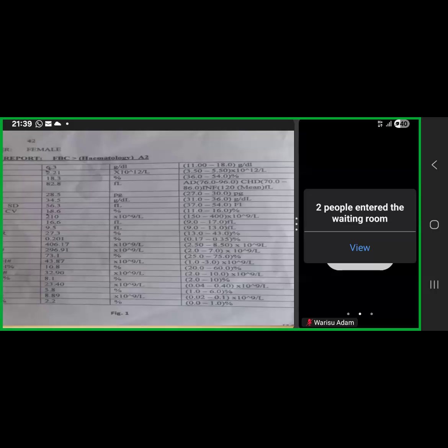The monocytosis on the full blood count results from the analyzer having determined the primitive cells as monocytes. Myeloblasts will scatter the same way as a monocyte. After all, a monocyte is a large cell with a large nucleus.